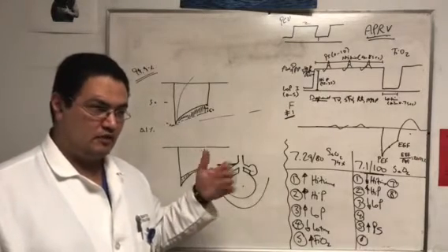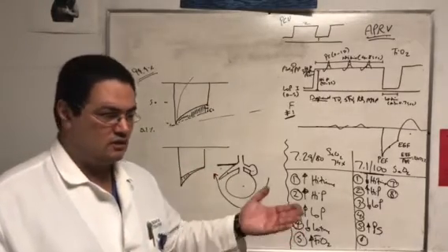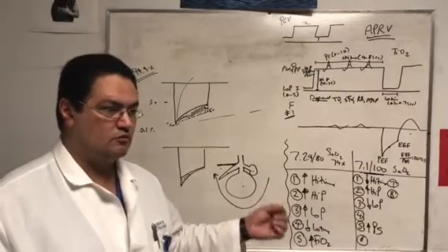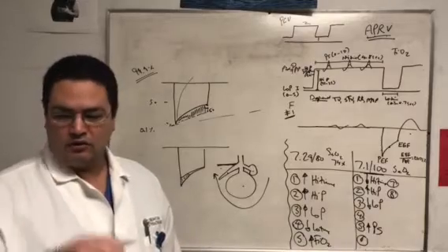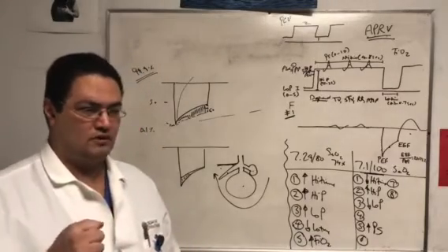Number 2, this mode of ventilation, another claim to fame. Remember the claims to fame? I don't know how many we have said so far, but another claim to fame to this mode is that it's not only a recruitment and weaning mode, it's a mode of ventilation that improves VQ matching. Why? All the controlled modes of ventilation, volume control, pressure control, all of these things, it gives you pressure.